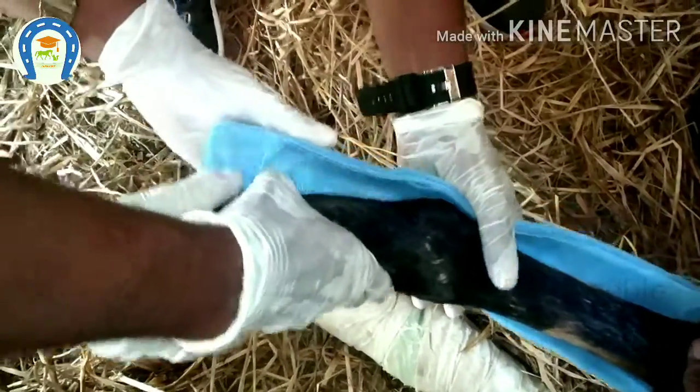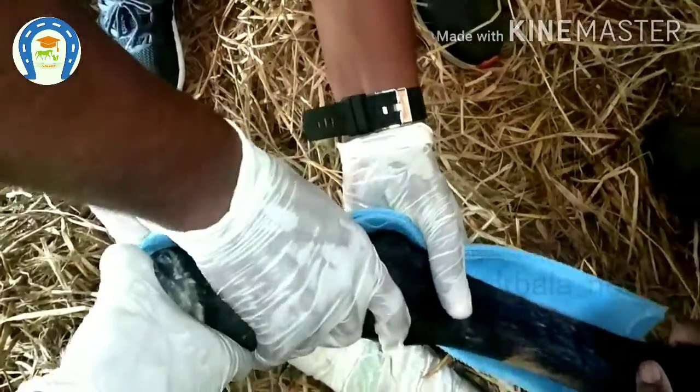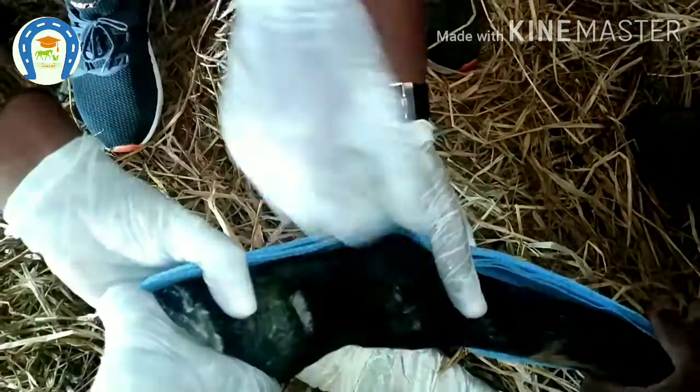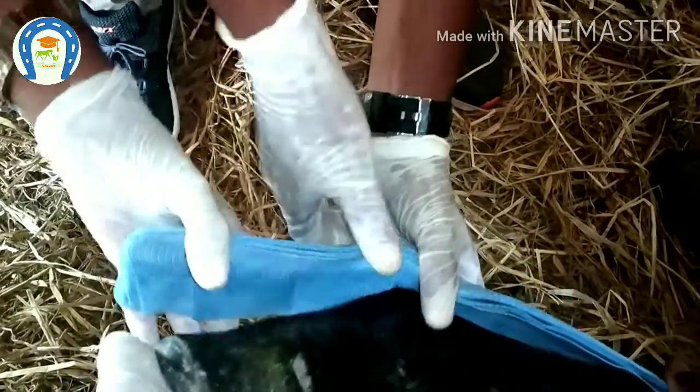If we choose a PVC pipe, even if we bend it, it may break within one or two days. And plaster of Paris will not bear the weight either — it is also easily breakable.